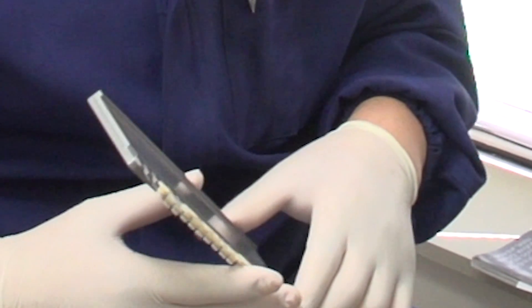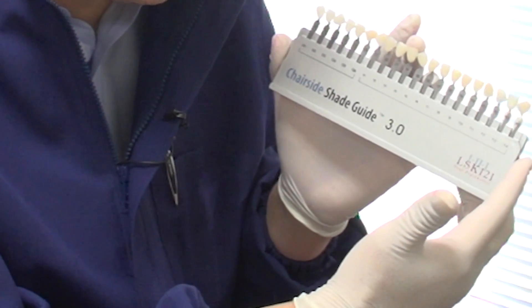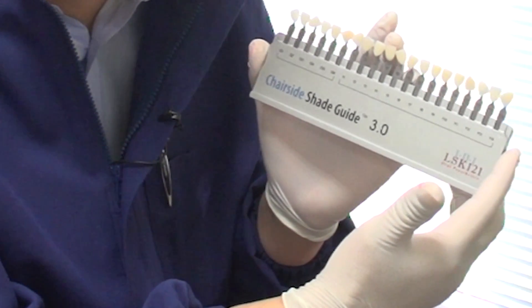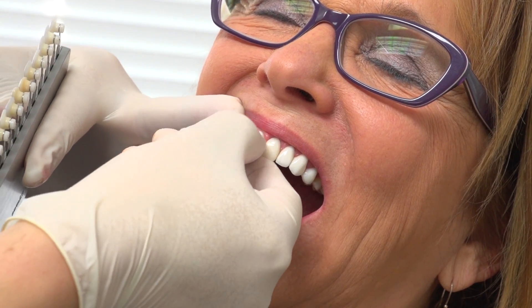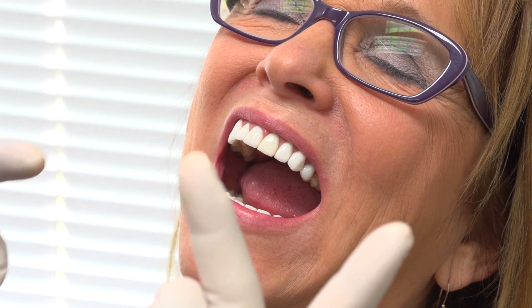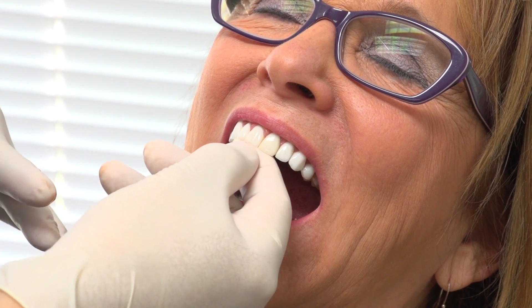I would like to discuss how to match the existing veneer color a patient already had for eight years. Number nine was cracking, so I would like to show how to utilize my shade tab so our technician can duplicate the color. When I see the color, I try to indicate it in two portions — half and half — because the patient has existing veneers.